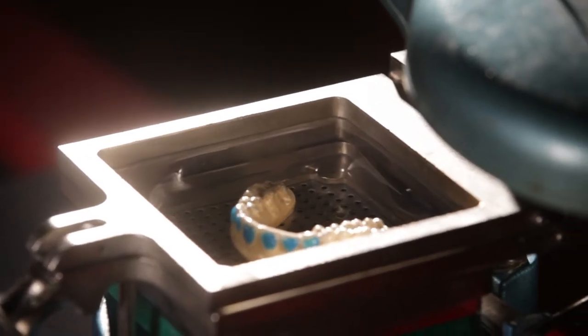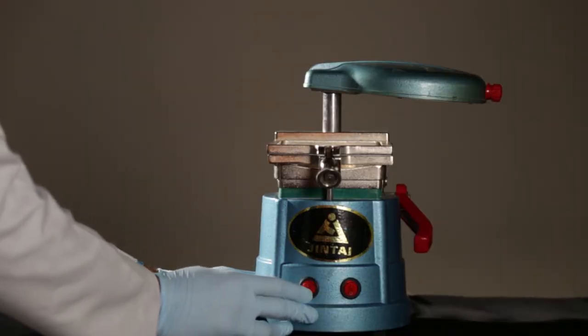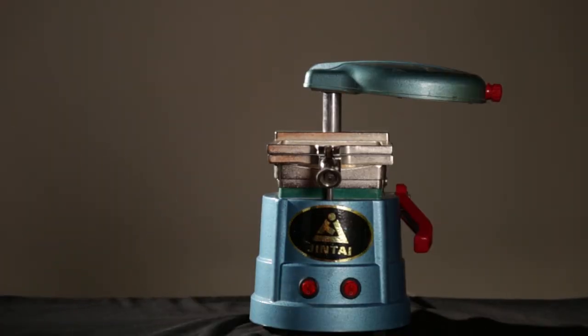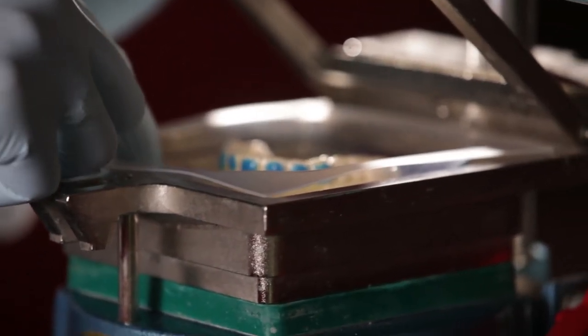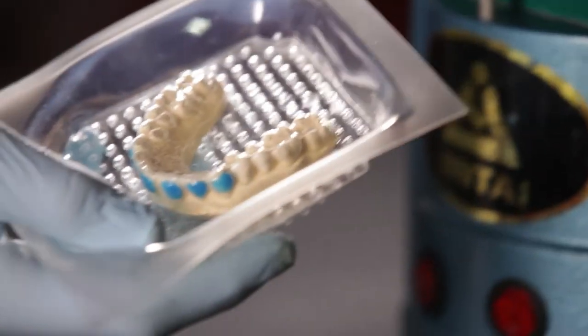You can see how it is closely adapted to the cast. After a couple of minutes, we can turn off the vacuum. It is very important to let the tray cool down before retrieving the model.